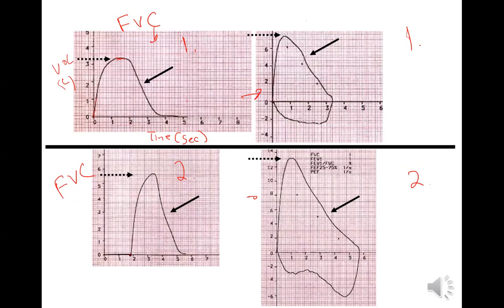Okay, so this is the other guy or girl, and it's okay. They started late, but it's okay. I still got the volume, which was 5.8, we'll say. So here's what we've got to do here, and this is really important. We take the first second, and you can do that here too. You just have to put it there. You kind of have to extrapolate that up in a straight line. So what we're going to do is take the first second of FVC, and that's called your forced expiratory volume in the first second, your FEV1.